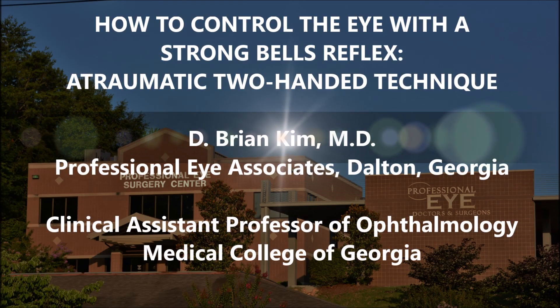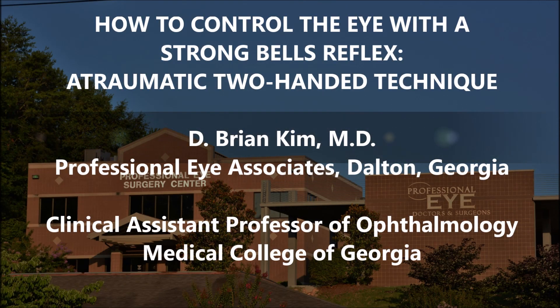Hi, this is Brian Kim. I'm going to share with you this case of a patient with a very strong Bell's reflex, and I'm going to show you an atraumatic two-handed technique. You need two hands in order to control an eye that won't straighten out, or when a patient is not cooperative. So an atraumatic two-handed technique is really the way to go, and I'll show you how I do this.